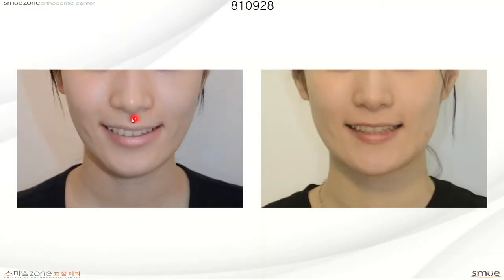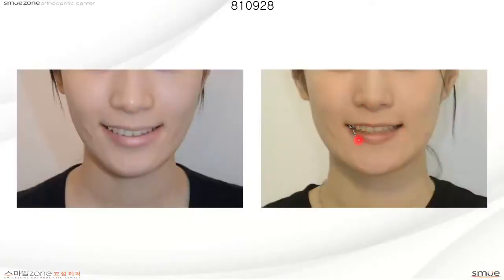and it's getting better. I told her that this is not because of the position of the teeth. As you can see here, the problem is that her soft tissue tension on the right side is much greater than on the left side. But she thought that it was canted. So okay, by intruding this right side alone, it gives a better look.